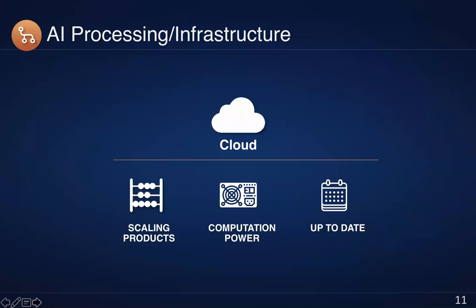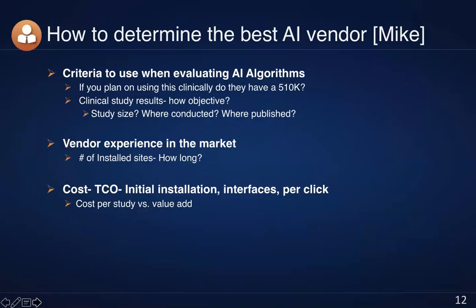It's interesting, Elad, the points you make about the cloud. They're very, very valid, and also, it was kind of funny. I had a client of mine that asked me, "Well, can I run AI on my PACS?" And when I finally picked myself off the floor from laughing, I said, "The server that you have now can barely take care of the PACS alone, let alone provide you with the computational power and the speed that AI takes."